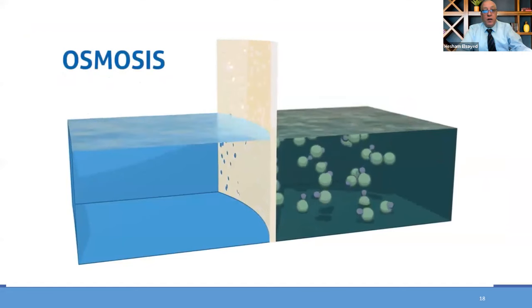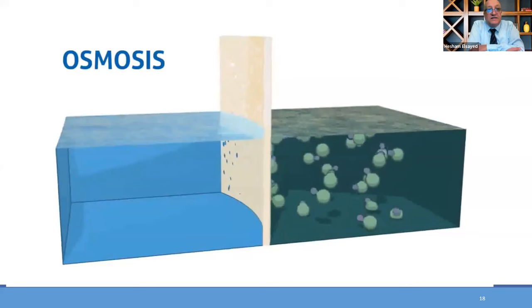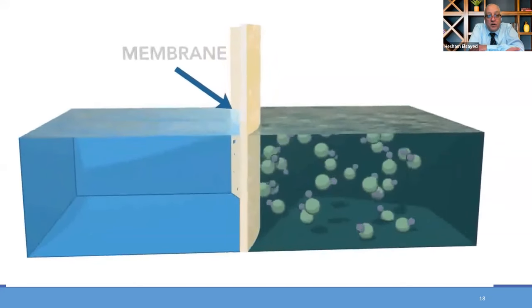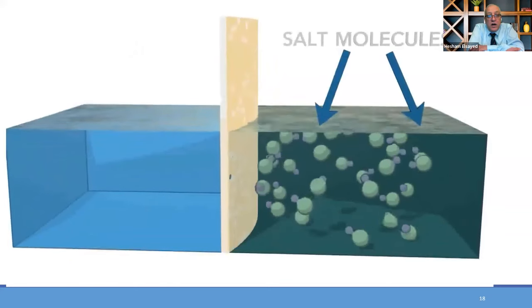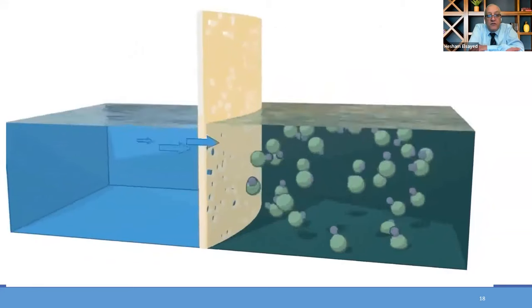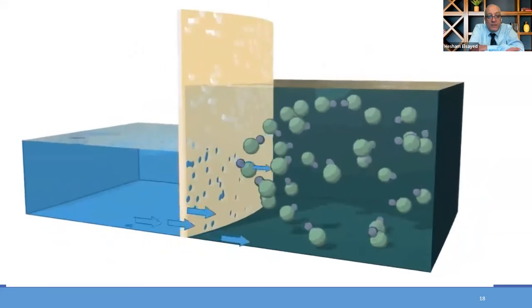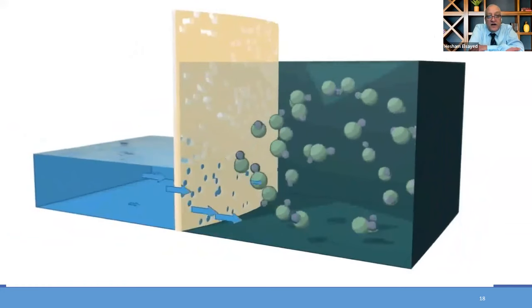Reverse osmosis means that we reverse the physics of osmosis. In osmosis, water permeates toward the high concentration by osmotic pressure. However, using the RO system, the more purified water is pushed out to the hemodialysis machine, and the rejected water, carrying the maximum solutes, comes directly from the drain of the reverse osmosis.